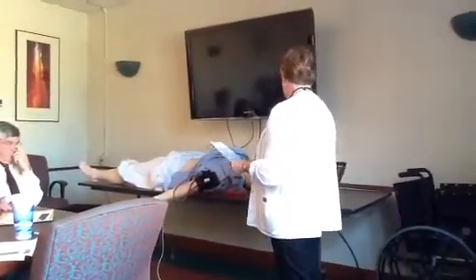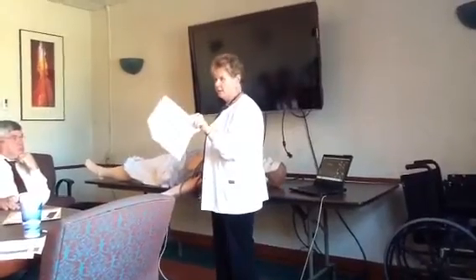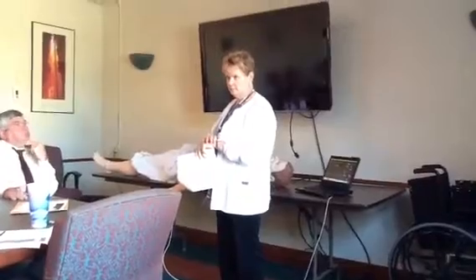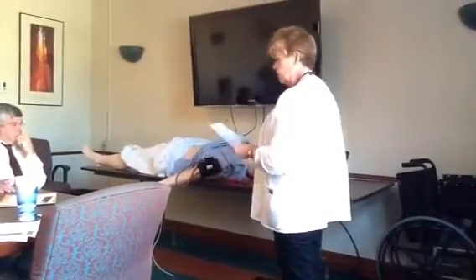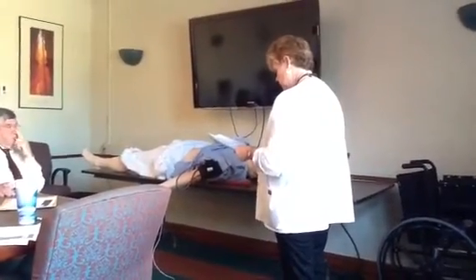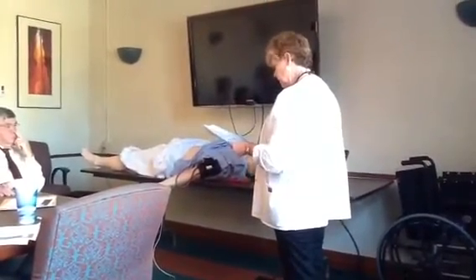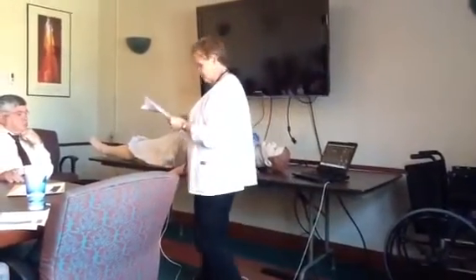You can do CPR on him, and when you do CPR, you can actually see on that computer whether your chest compressions are the right depth or not, and it really talks you through it, which is very cool. It's like the old simulators we used to use. You can, like I said, have IO access either sternally or in his tibia.